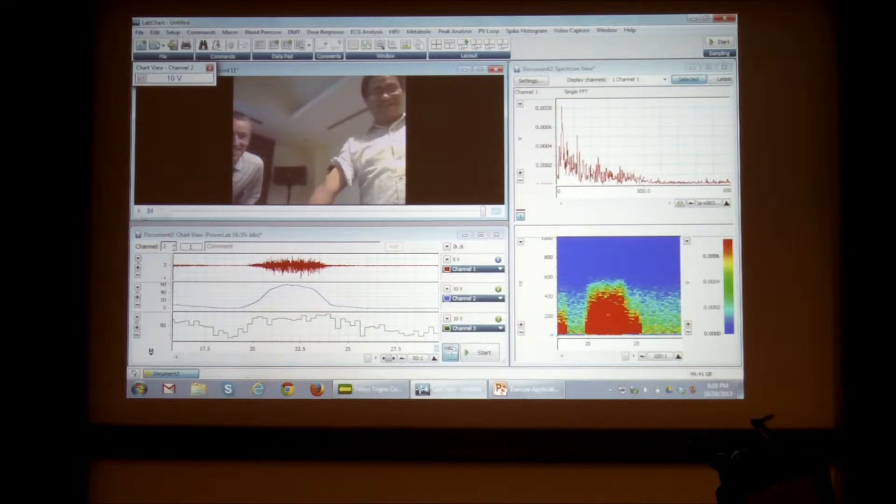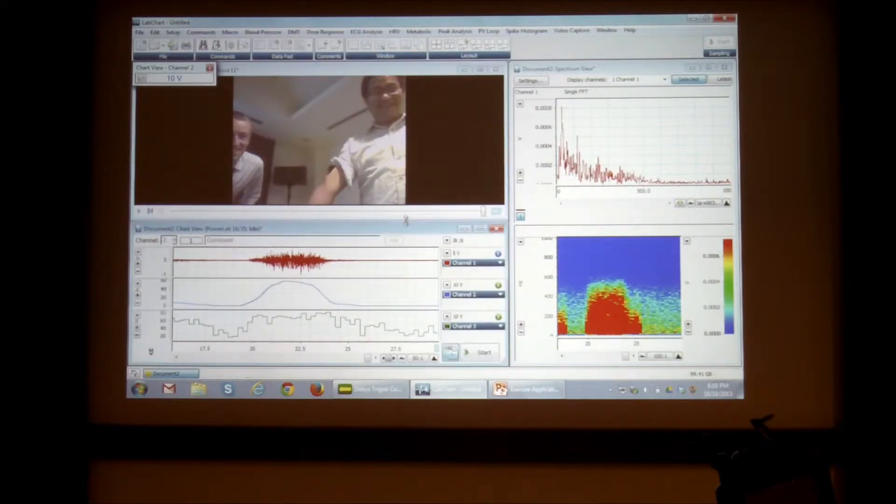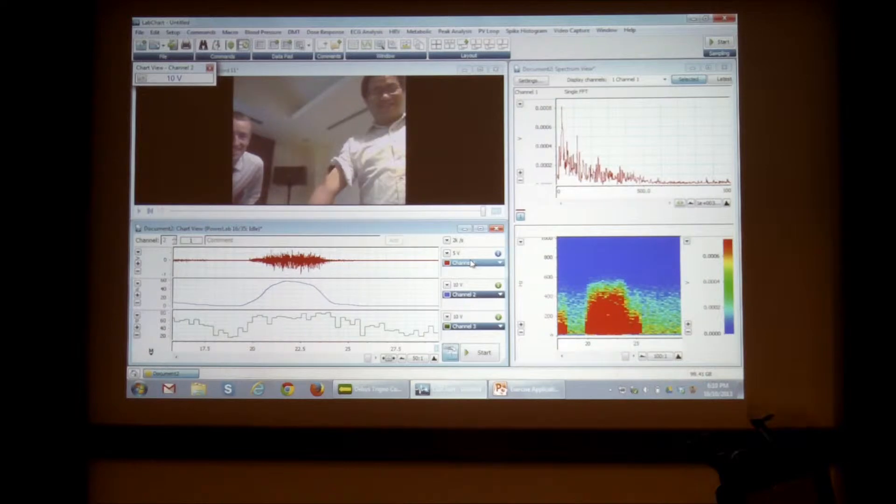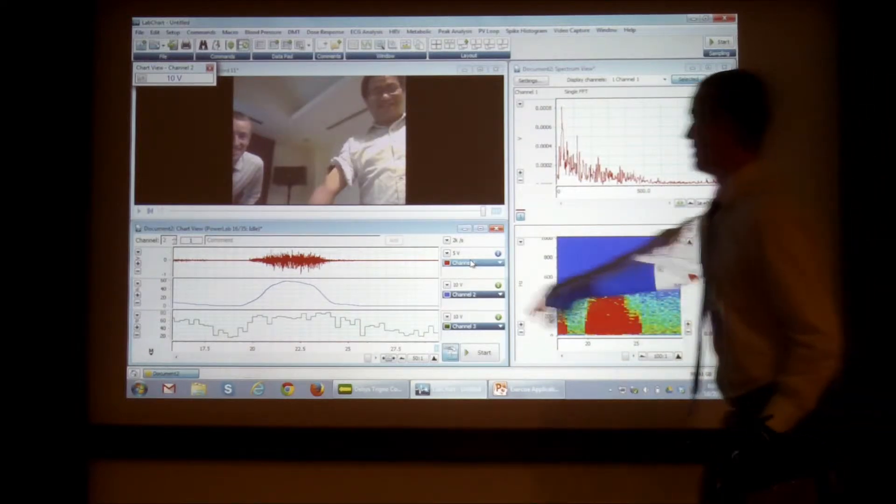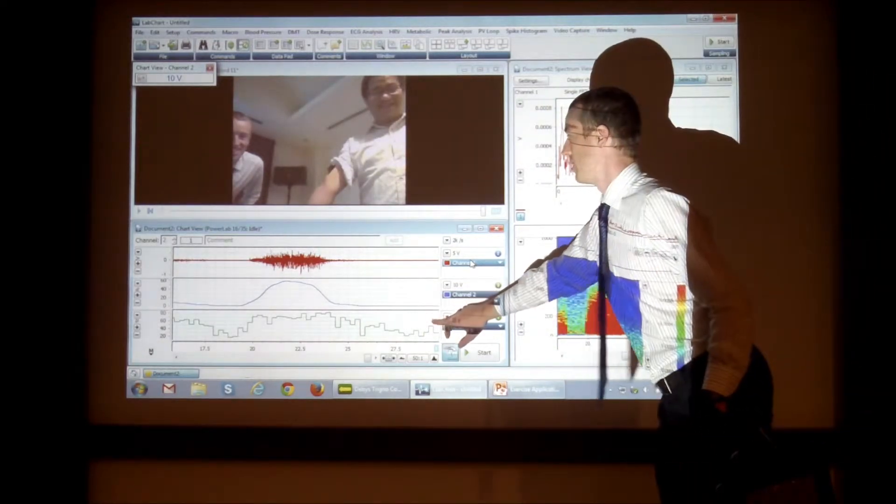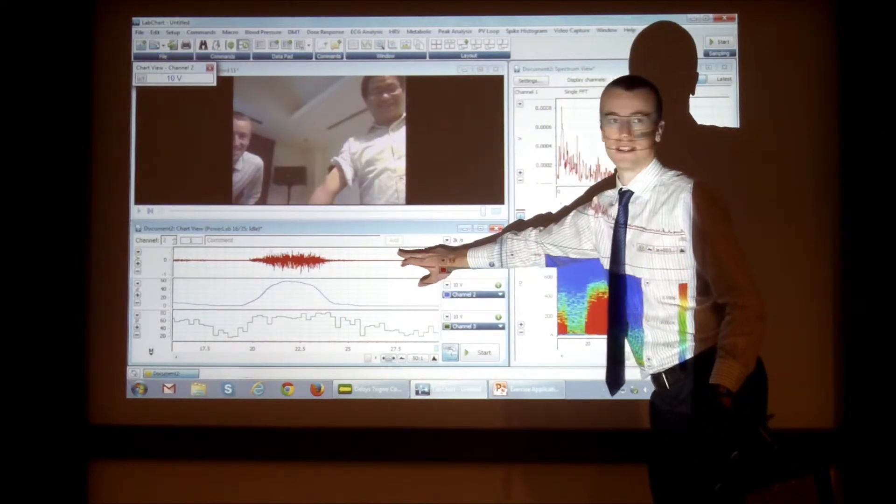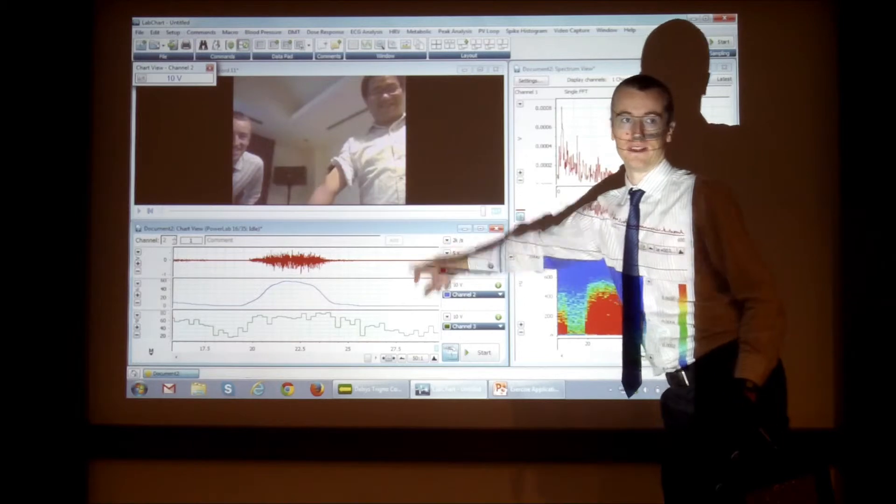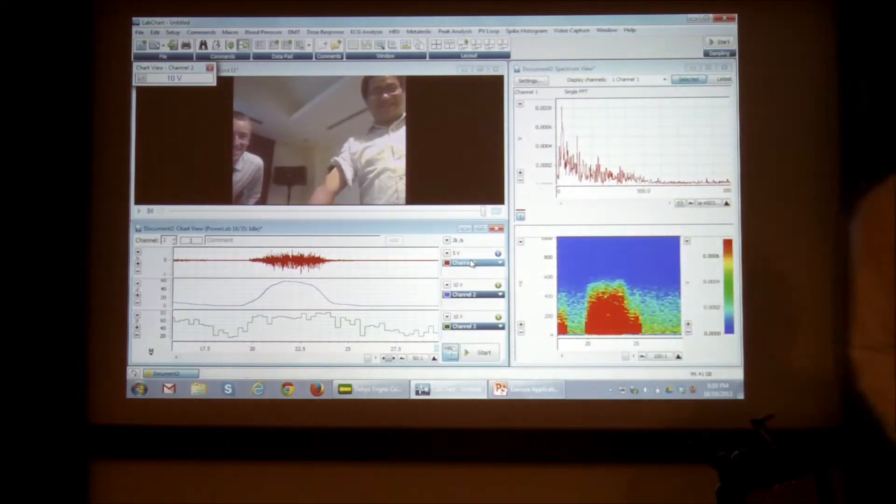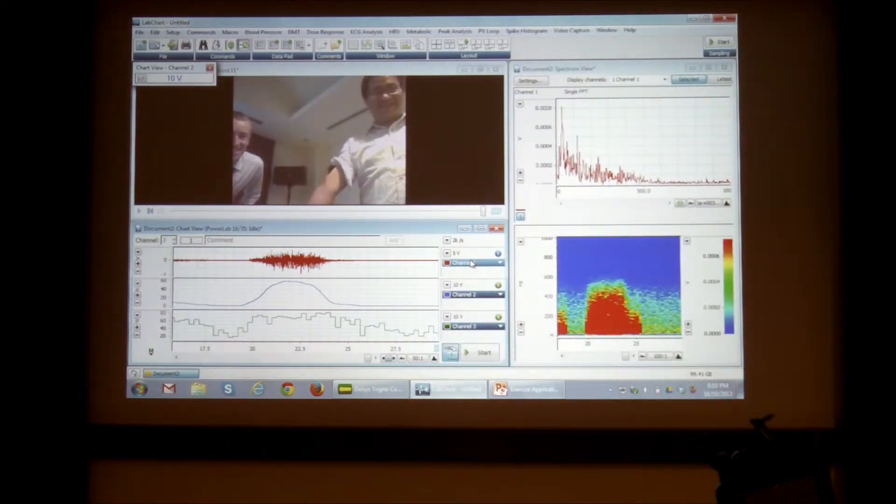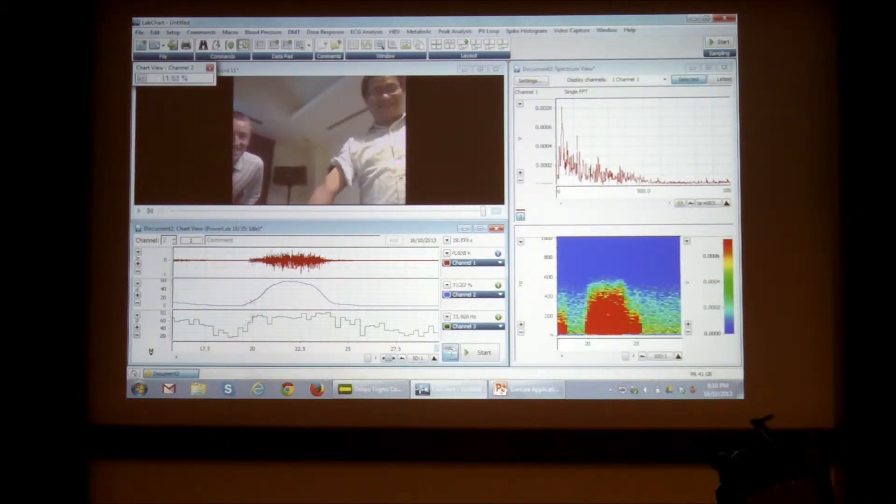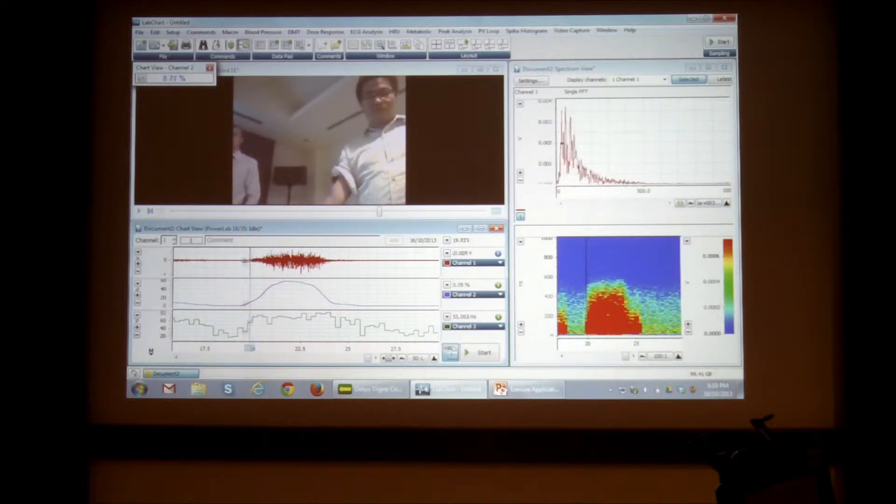And if there was a synchronization problem, all you need to do is you go to your source data, because remember this one and this one is based on this one. And all you do is you work out the difference in time, so you can click around and work out the difference.